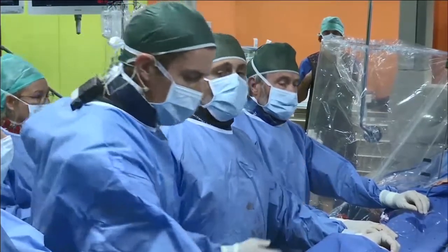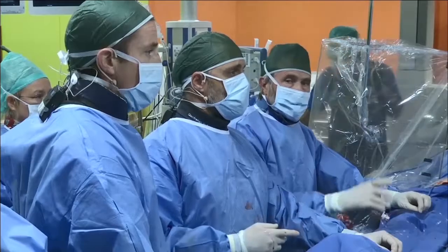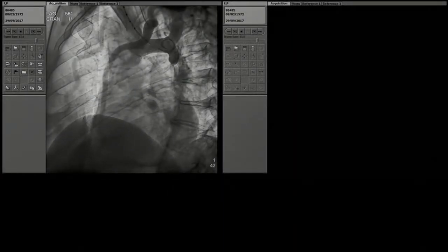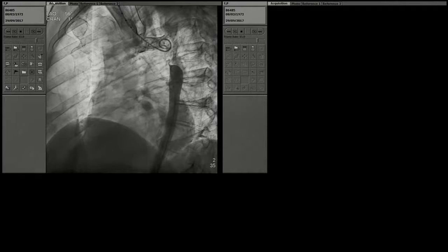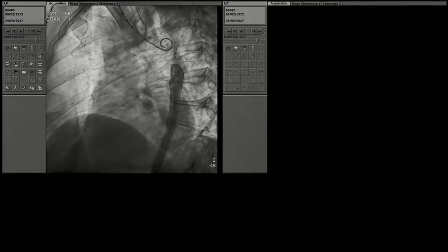And let's go to pictures now. This patient had a CT scan. And we fused the pictures from CT scan together with the angio and with the actual cut. So you see the injection from above. There is a very tiny passage from above.